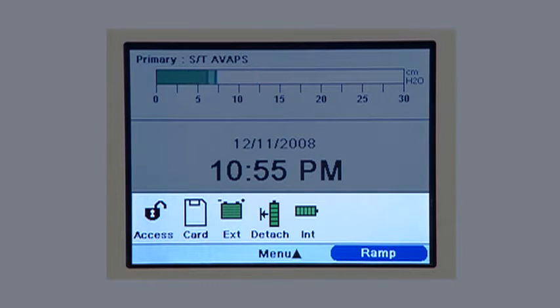When an external battery is attached, you see this. When the symbol is green, the battery is fully charged. The level of the green shading will go down as the battery charge decreases. You know the detachable battery is in place when you see this symbol. Here again, the amount of green shading gives you an idea of how much charge is left in the battery.